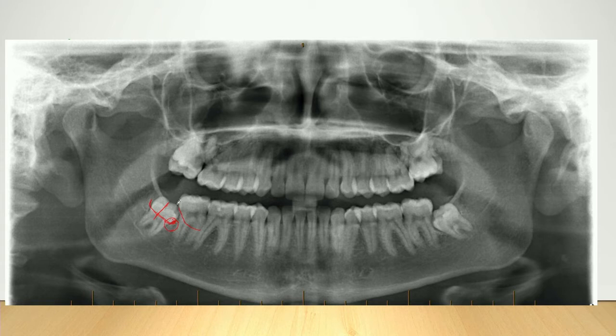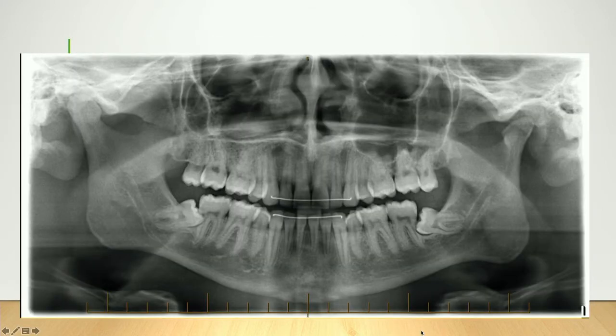Then sometimes I would come up the ridge a bit and then do my distal relieving. Sometimes I just basically do a triangle, okay? And that would open that up nicely. So the same in this situation, a quite difficult impaction. I need access to the mesial, so I would do a mesial relieving incision and then distal. Sorry, not really to proportion, but you get the picture. Similar situation here.